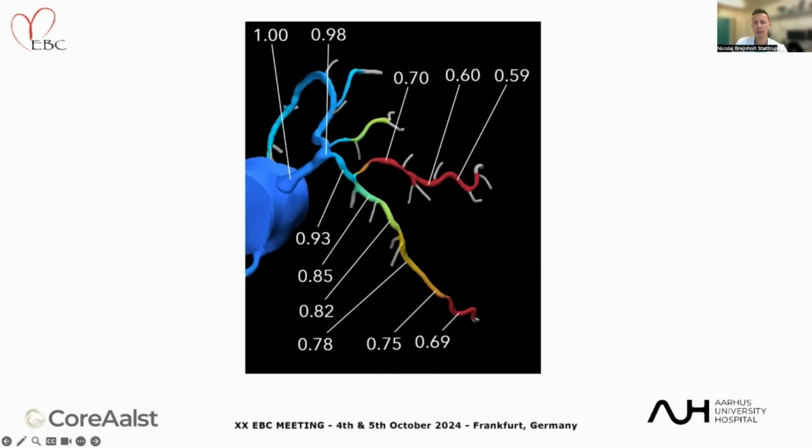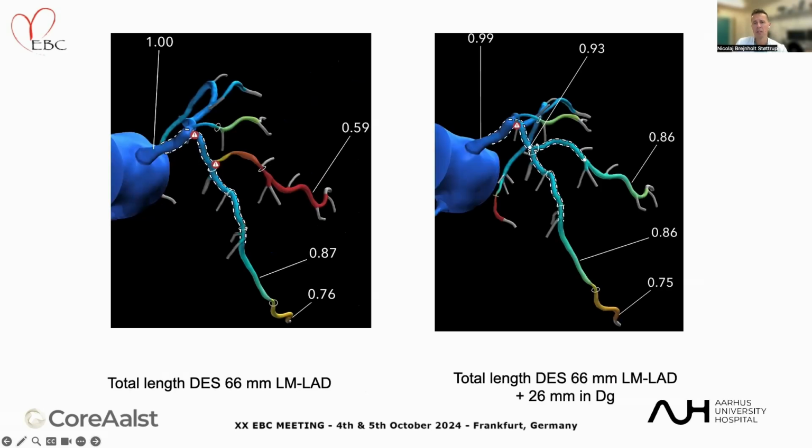A computational fluid dynamic model was created by HeartFlow and showed a significant pressure loss across the LAD and first diagonal branch. By using these in silico prediction models, two stent strategies were developed. One proposing a provisional approach across both diagonal and circumflex, and a two-stent strategy involving the LAD first diagonal bifurcation and a provisional approach across the left main.